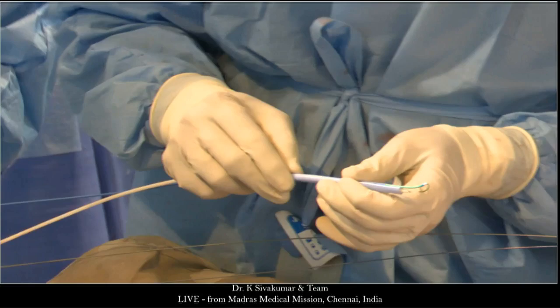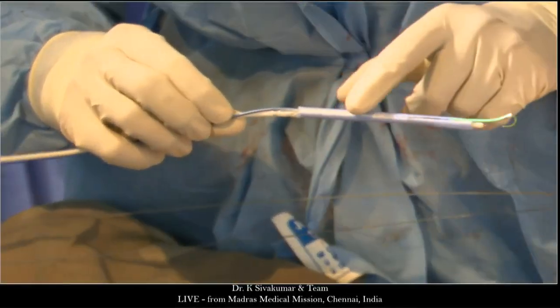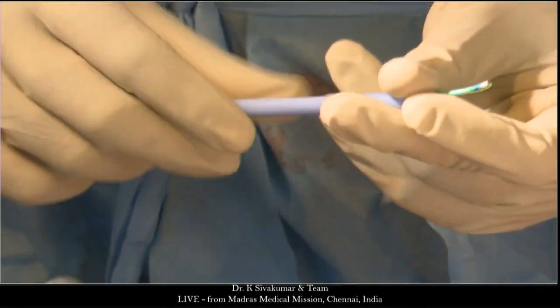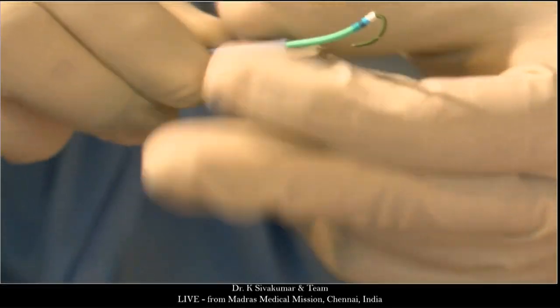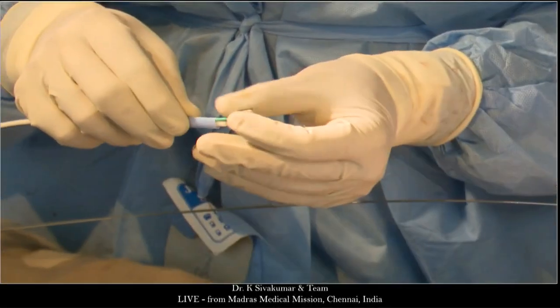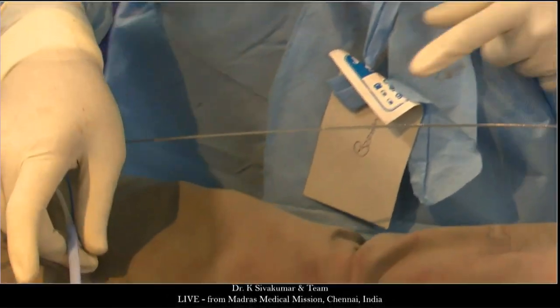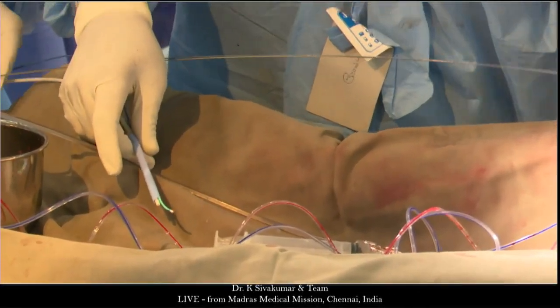So now I will show you how we have crimped. Can you see the cut sleeve here? Yes. So this is the sleeve that I am modifying a little bit. At this point, I am taking out the stylet. I am taking this guide wire out of this. So now I have two guide wires that are coming out here. One is the Lunderquist and one is the Amplatz Superstiff.